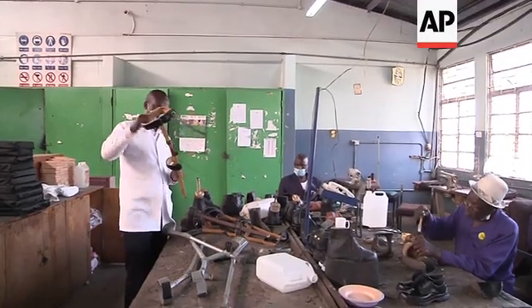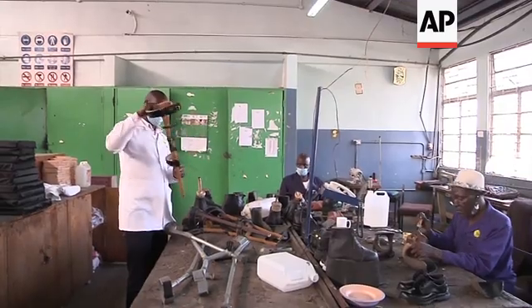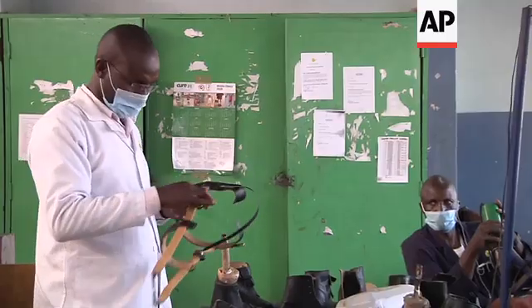It's not bulky, and it's easier for persons with disability to handle. It's quite a game changer in terms of amputation and rehabilitation — quite different from what we've had before.